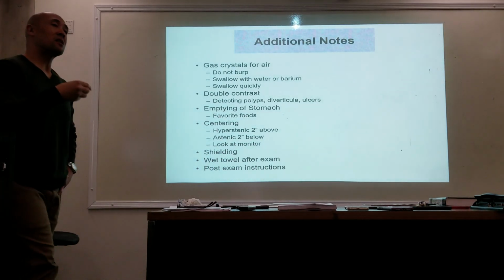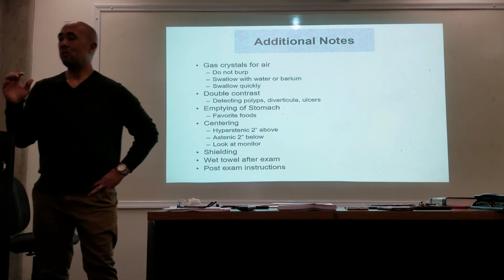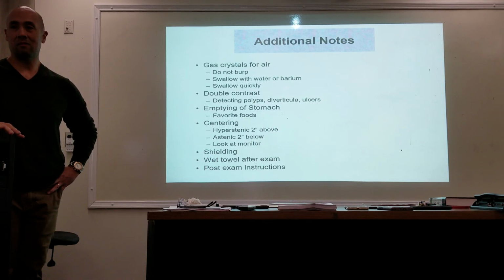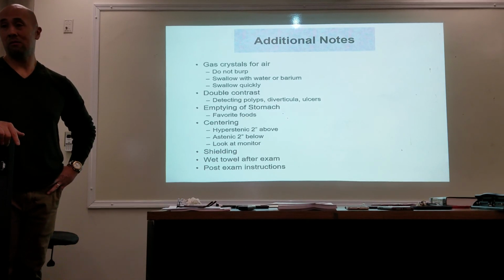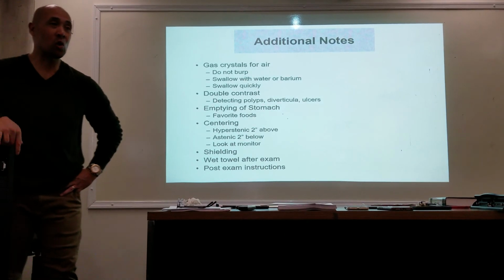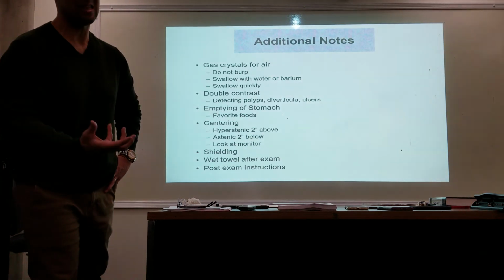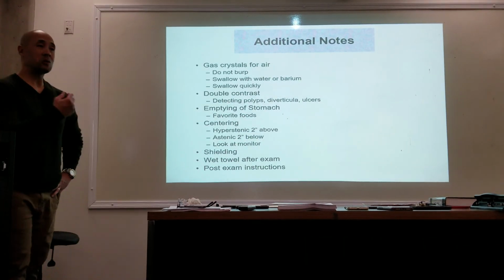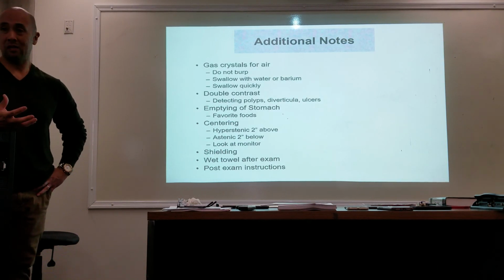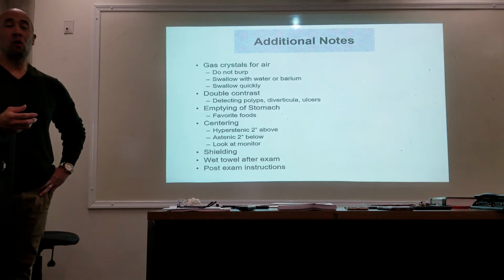So what you're going to tell them now is, Miss Jones, we need you to drink plenty of water for the next 2 to 3 days. Okay? And then you can say, as long as it's fluid, it doesn't have to be water. You like juice, drink juice. You like beer, drink beer. Whatever their preference is, just make sure that they drink plenty of fluids and they understand that. You also got to let them know not to be alarmed if their stool is white. It's going to appear white for the next couple of days and will go back to normal color.